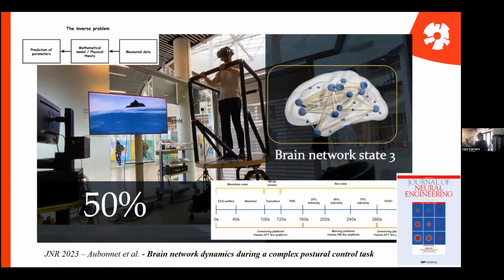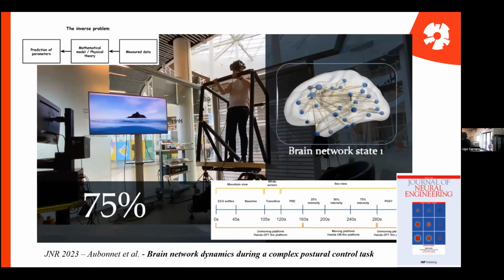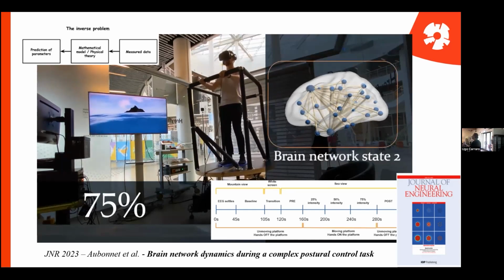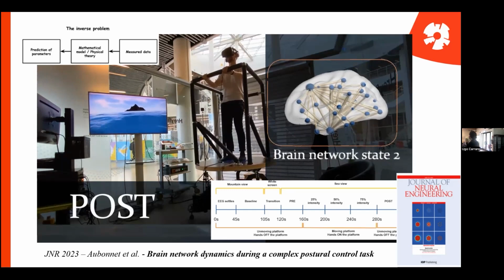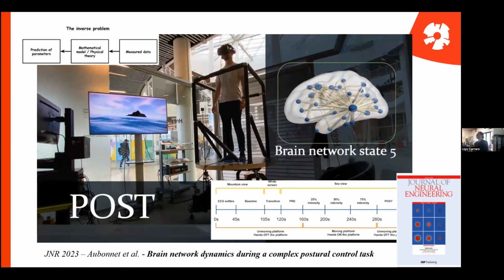And this is very important because in the evaluation of degenerative conditions, today we don't have a real analytic that can tell you if you have or not a certain neurophysiological disease. So we hope that we can use the indexes that are the results of this analysis to give evaluations that are a lot more sophisticated and real. And you see, when the platform stops, the people continue to sway, and also the monitor, you see. It's a very important and very eloquent phase of the experiment.